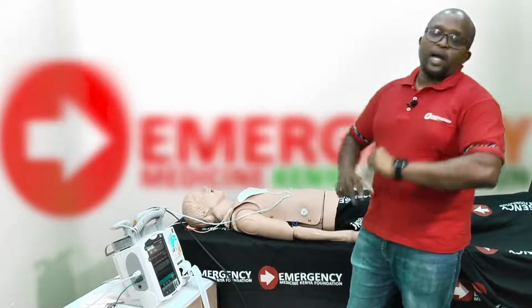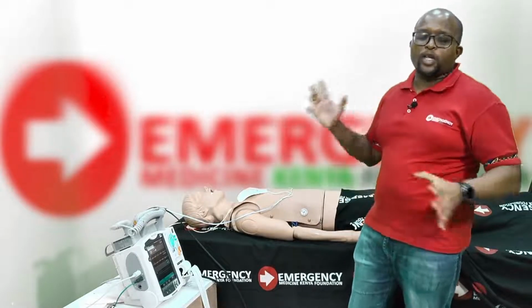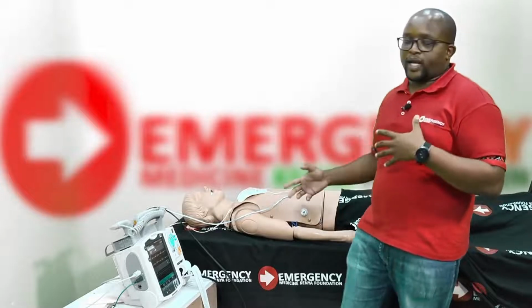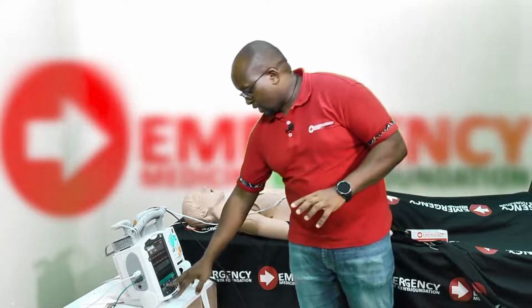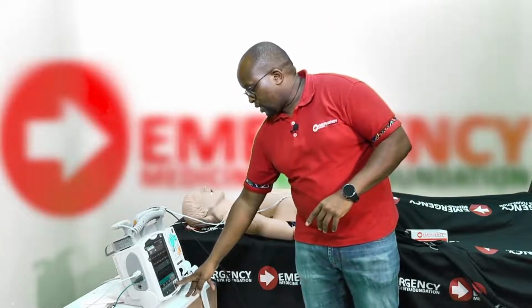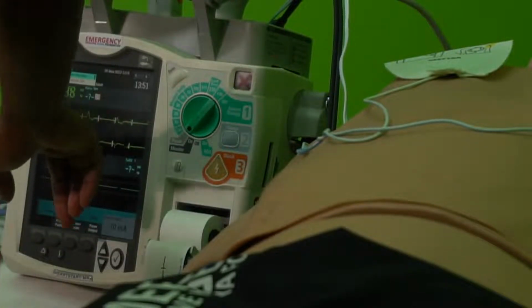So the process. Again, we've gone through the whole process of indications. Patient is hypotensive, has a low heart rate. There's no metabolic or electrolyte reason they should be having this heart rate. They have features of shock: hypotension, altered mental status, shortness of breath, chest pain. In which case, I will start pacing the patient. So pacing is already started. Then my heart rate I'm putting at 70. Then my output I'll go to. So as I said, we got capture there.